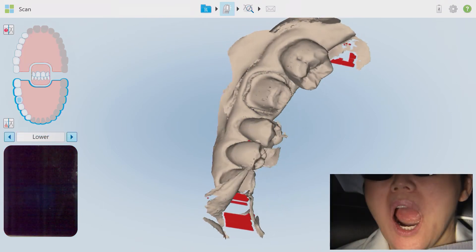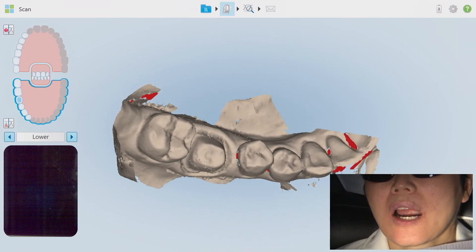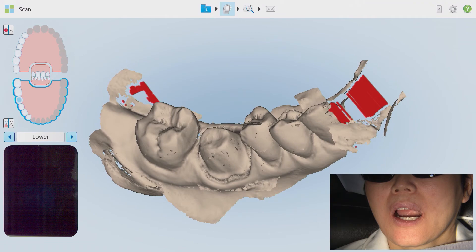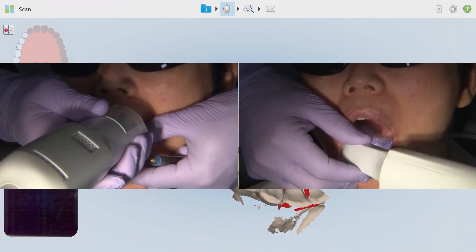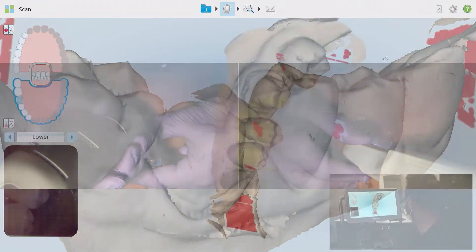This patient holds her lip just a bit more tightly to her teeth than I'd like, so I switched my hand just to hold the wand tip steadier throughout the anterior section. After a good amount of experience with the iTero Element, you'll also develop your own comfortable workarounds for more difficult areas. Perfect hand position in my opinion is defined as your most solid ergonomic grasp in the moment that acquires the highest quality data in the least amount of time with no patient discomfort.